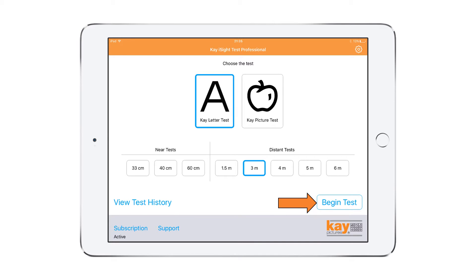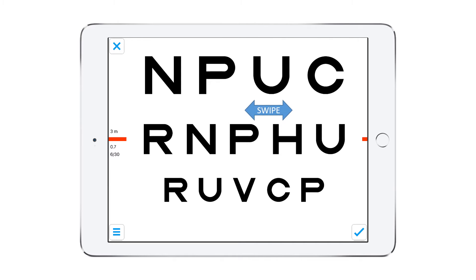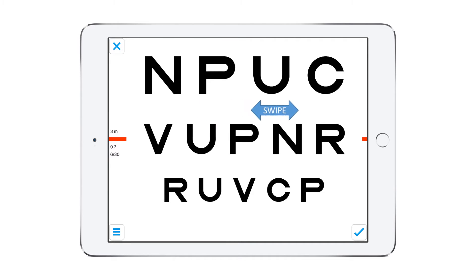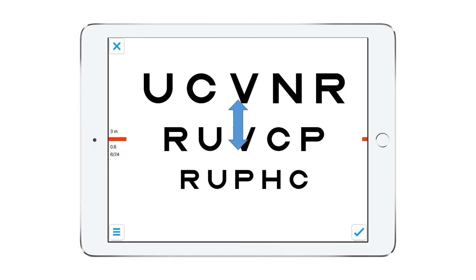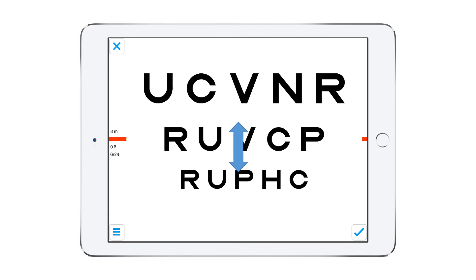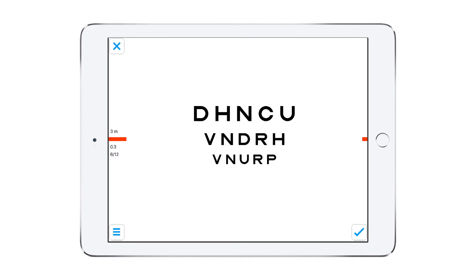When you begin the test, you have a choice of displays. Swiping the screen will refresh the letters shown, and swiping up and down changes the sizes. The displayed size is shown on the left of the middle of the screen.